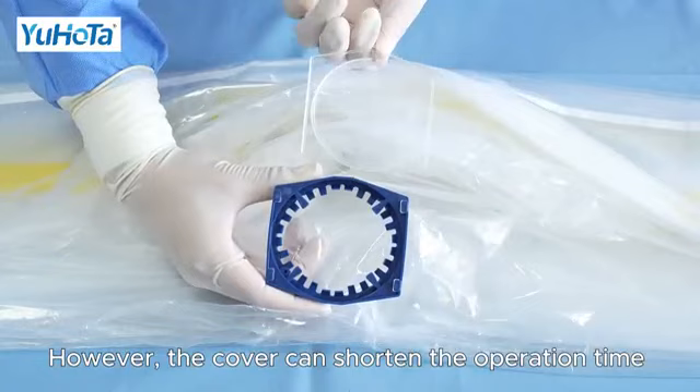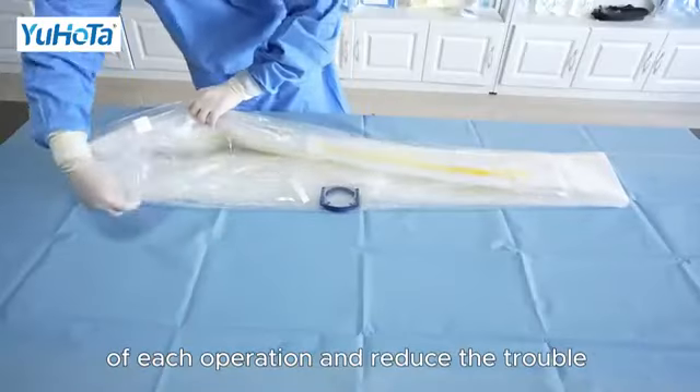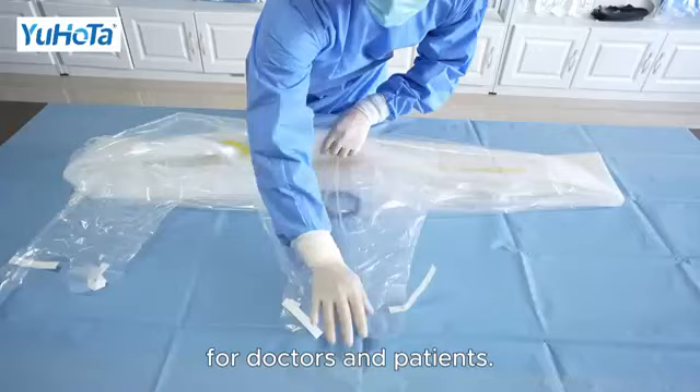However, the cover can shorten the operation time of each operation and reduce the trouble for doctors and patients.